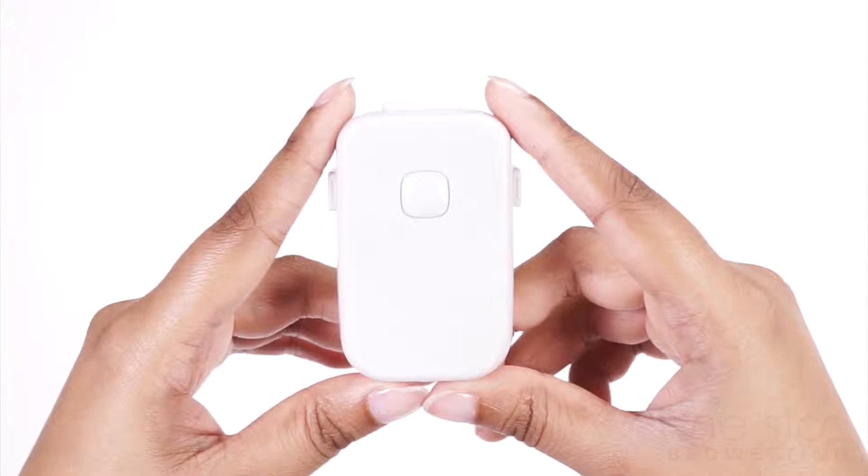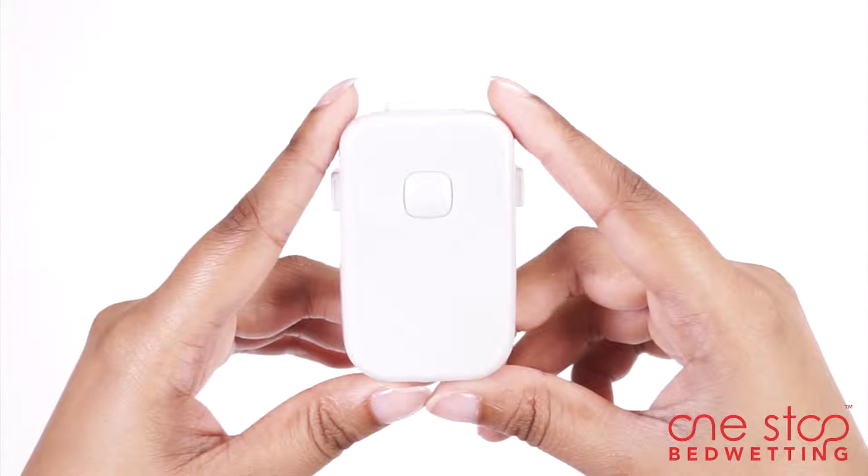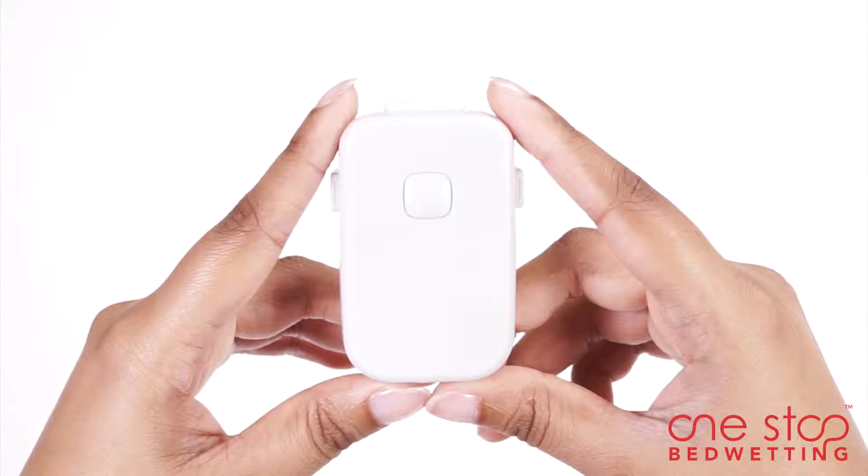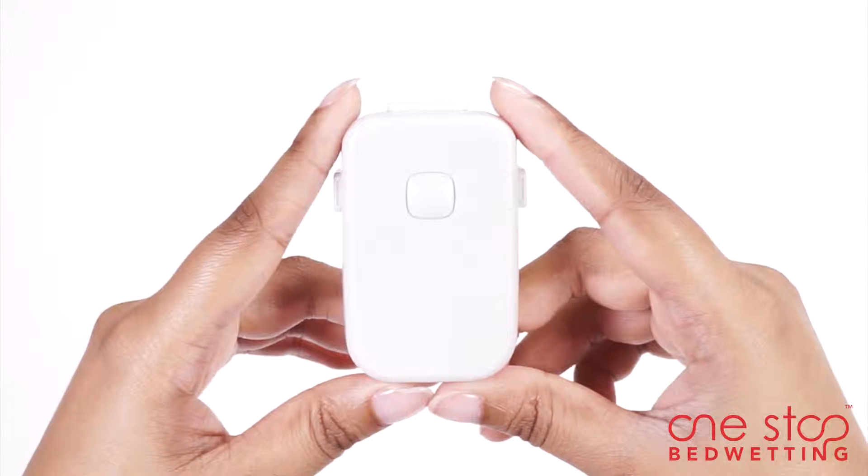Guardian Bedside Bedwetting Alarm is designed to offer maximum comfort and convenience for bedwetters of all ages. The alarm monitors bedwetting in children, teens, and adults by establishing a connection between the brain and the bladder.